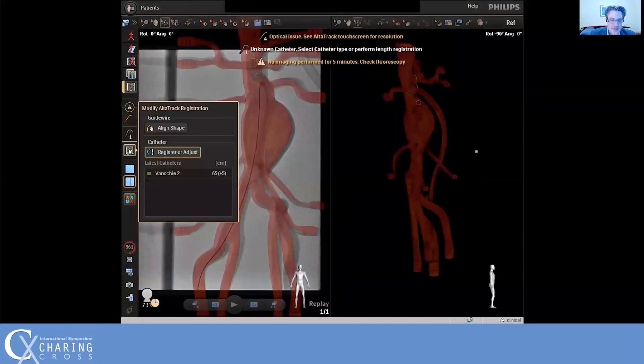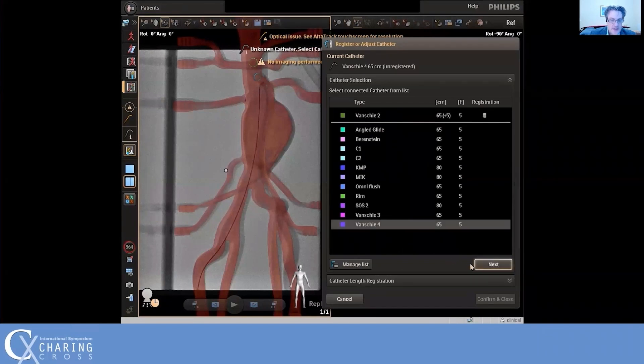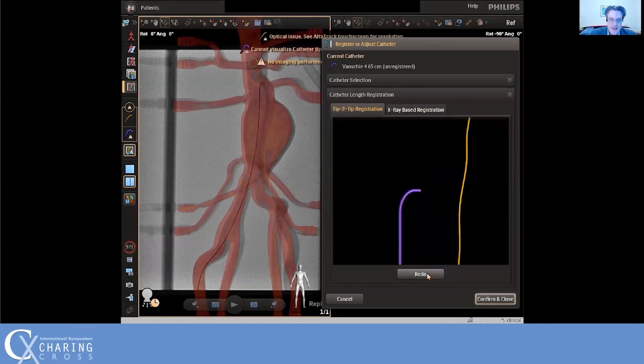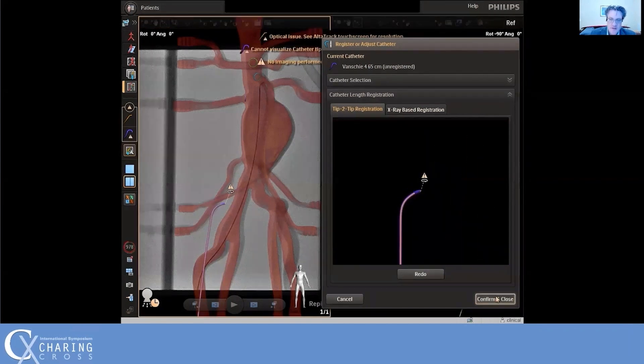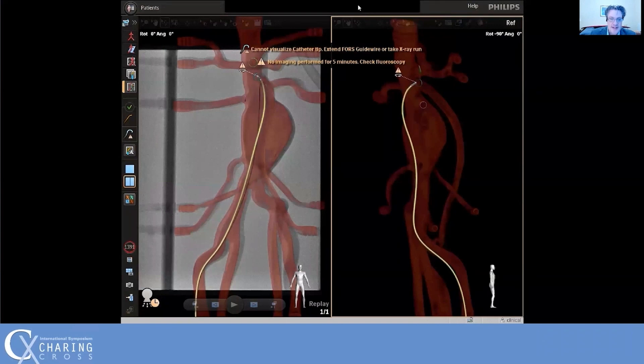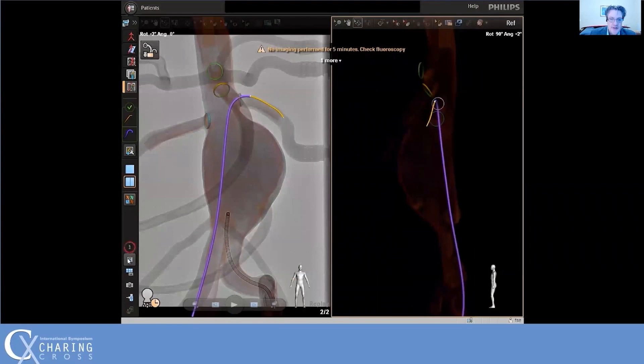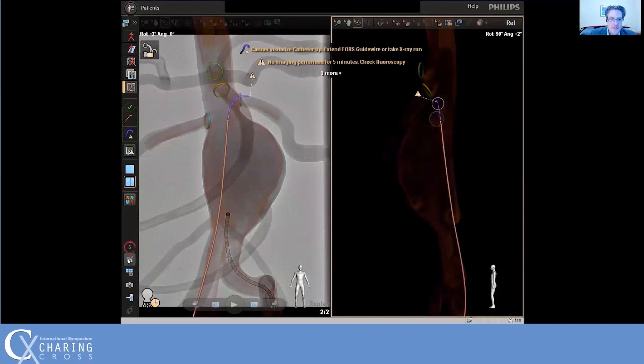Here we select a new catheter, in this case a Vanshee 4. The wire is introduced to the tip of the catheter, the position is confirmed, and it's ready to use. Here we use the Vanshee 4 to cannulate the SMA. The 3D hub does not interfere with normal catheter manipulation. If the wire is withdrawn into the catheter, the system will estimate the position of the tip, displayed as a dashed line. If the wire is withdrawn more than 7.5 centimeters, it will no longer estimate the position until the wire is re-advanced.